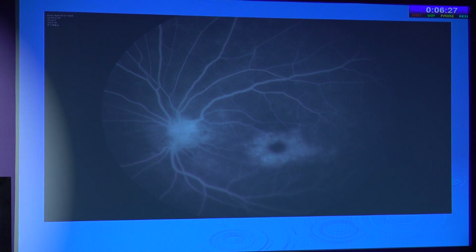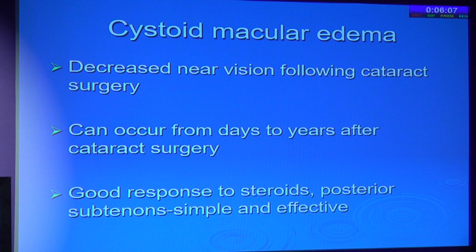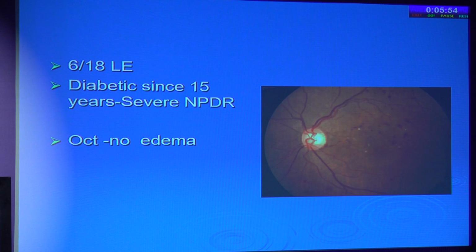Well, in a diabetic patient who has diabetic retinopathy and is having CME, you don't know whether it is CSME or it is a pseudophakic CME. The investigation that you can do is a fluorescein angiogram and look for a disc leak. When you have a disc leak, it is a pseudophakic CME. Otherwise, it is a CSME. Why is it important to differentiate? Because you can treat pseudophakic CME with steroids, posterior subtenon or intravitreal, and the other one will require better to be treated by anti-VEGF.